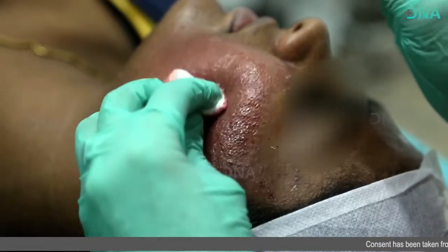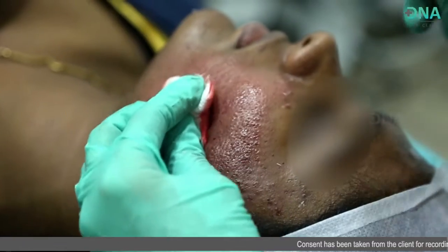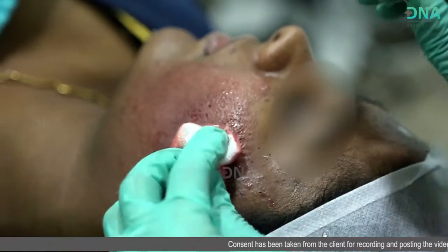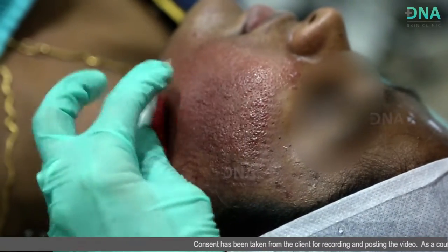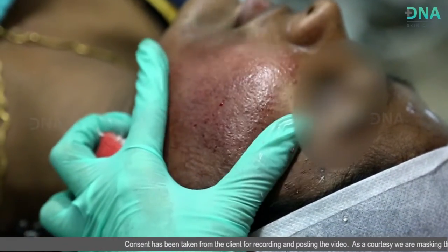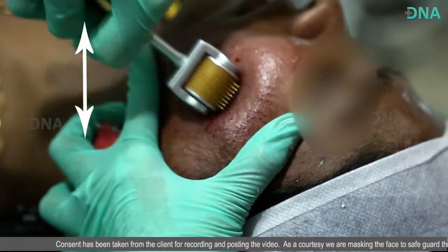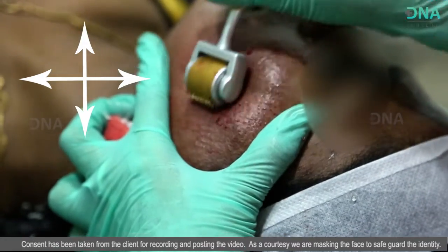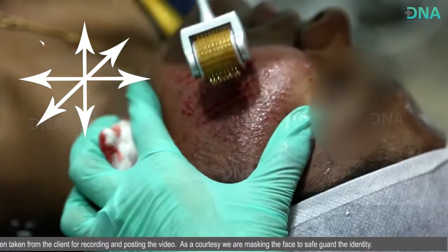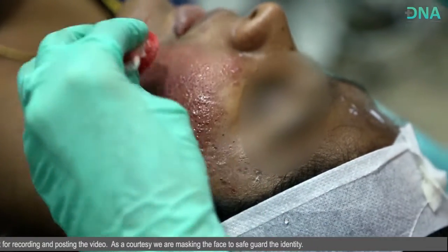So how do you typically do the derma rolling procedure? The intention of the derma roll procedure is to create multiple tiny injuries, as many tiny injuries as possible, onto the area that we're going to treat. So how I like to do this: first stretch the skin, give the stroke in all possible directions, up and down, side to side, then diagonal and diagonal. This way you make sure that you cover the entire area and create many multiple injuries.